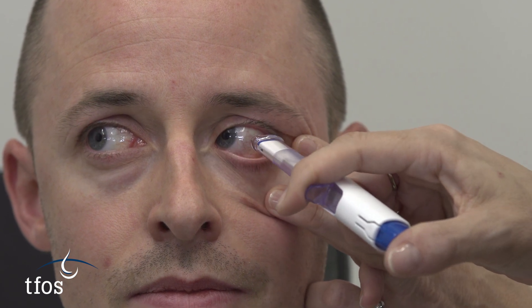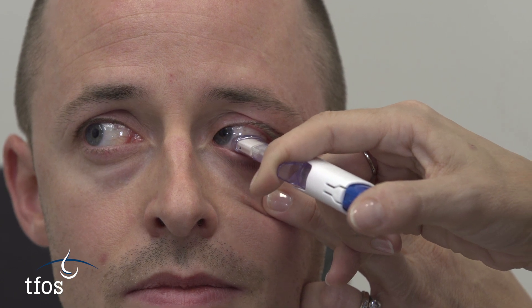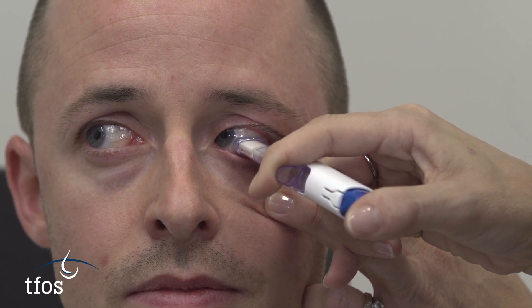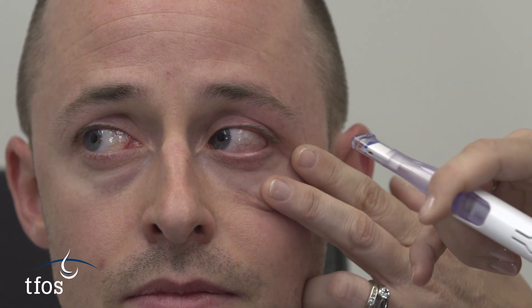When the eye has been anaesthetised with drops, the device is placed over the area of interest, gently touching the eye's surface. The plunger is depressed so that the filter paper is held in contact with the ocular surface for several seconds, and then removed from the eye.